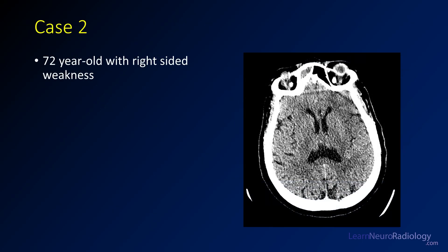Today we're looking at a case of a 72-year-old with right-sided weakness. Here we have a non-contrast head CT. A little bit grainy, a little bit hard to see. Looks like on the right, we have pretty good gray-white differentiation.